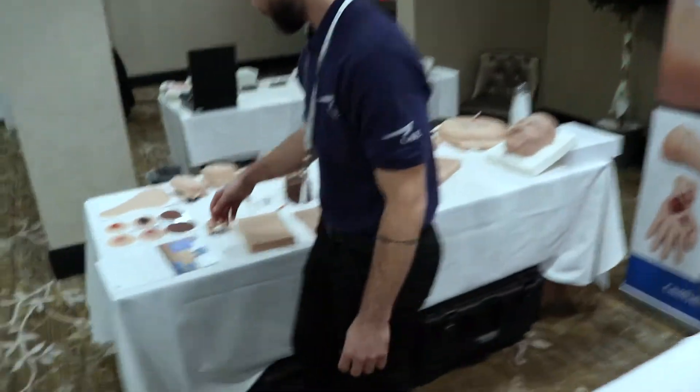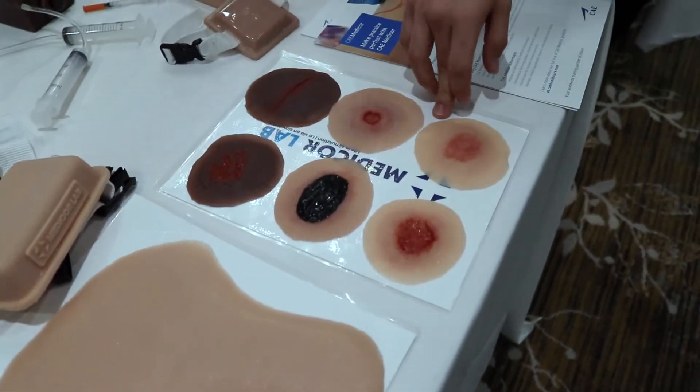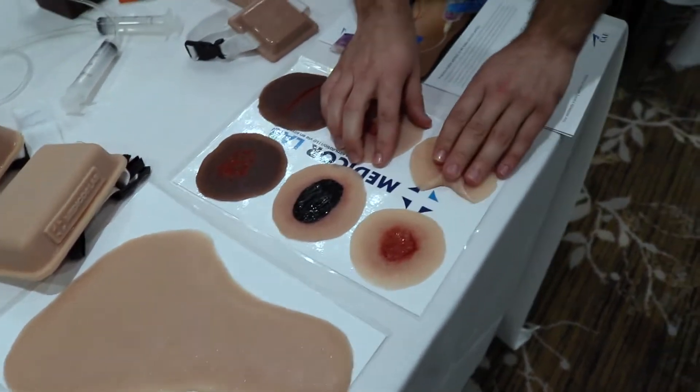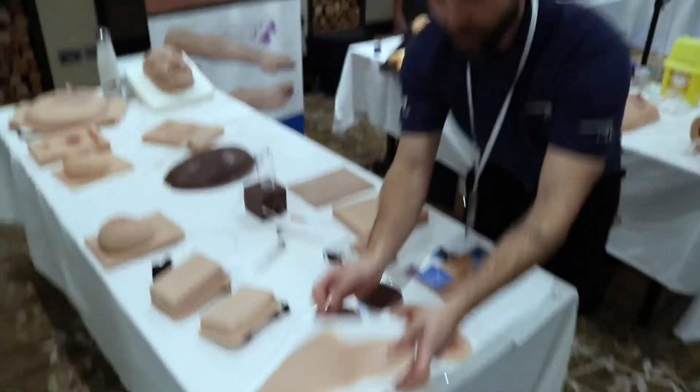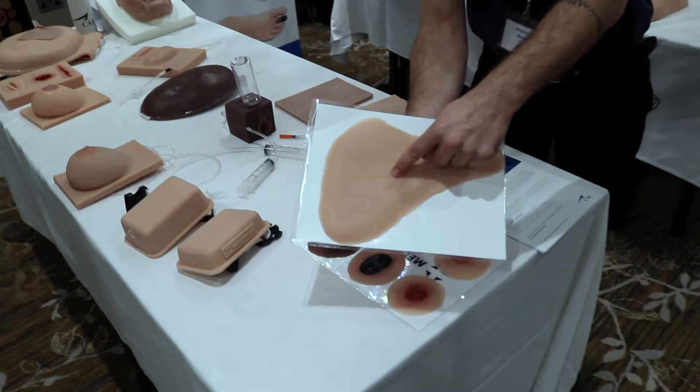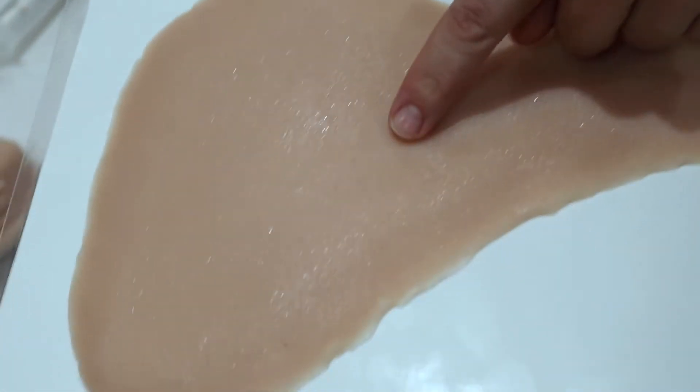Right here we have our sticky wounds that can come in packs of 6, 12, 18, and 24. Super sticky and will peel right off your mannequin. We also have pitting edemas — swollen ankles that will provide you with the perfect mimicking of those swollen ankles.